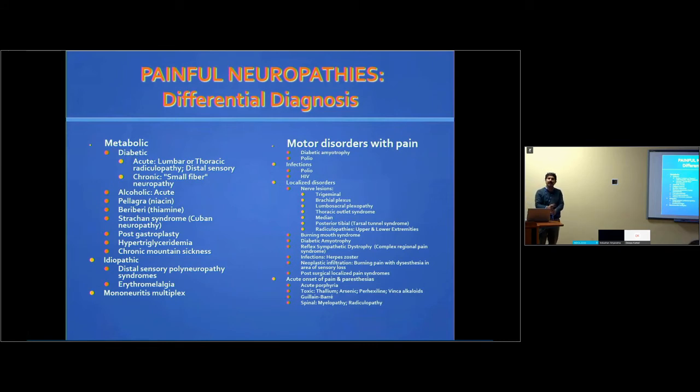But EMG helps me a lot because, luckily, we have the perineural hydrodissection treatment. It's not a long-term treatment. It provides relief for 4 to 6 months for most patients, and especially chemo patients. So I usually send them there. They're nice enough, they accommodate them soon. And they're comfortable, and then you can start working on tapering some of the medications down.